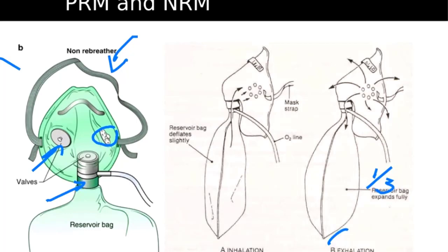So, as the patient exhales, there's going to be entry of the first third of his expiration into this reservoir bag. The remaining exhaled air goes out of these ports from the mask.